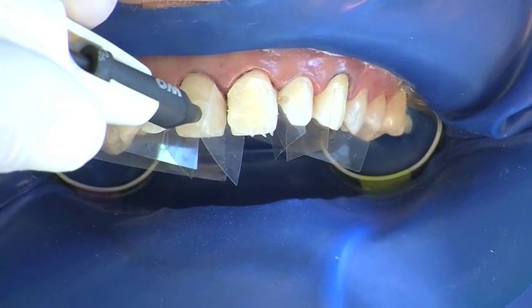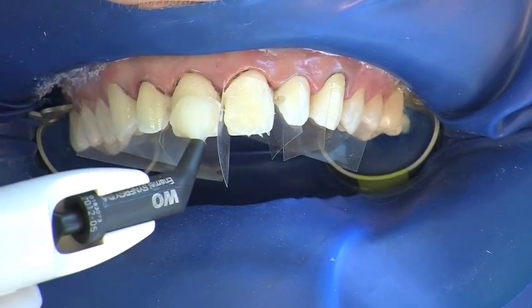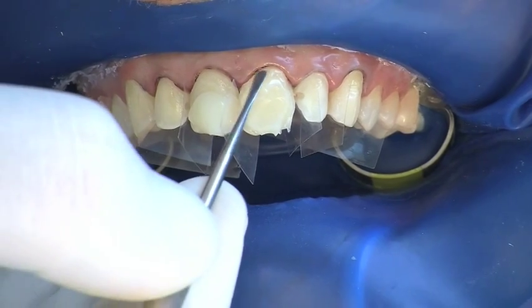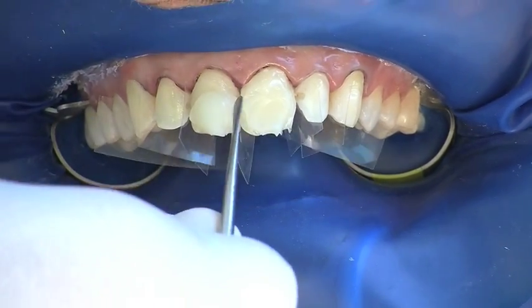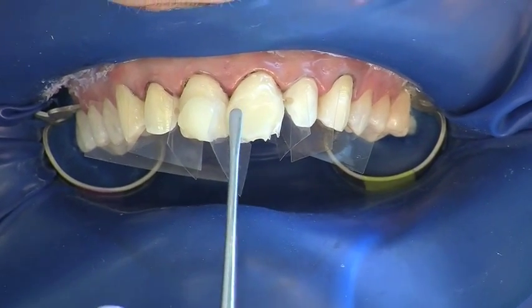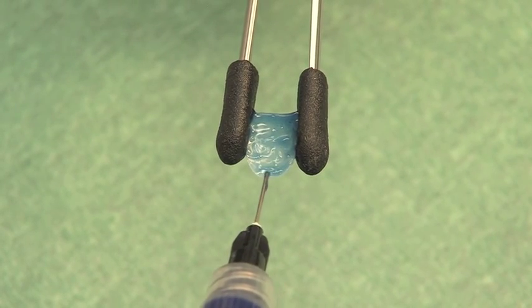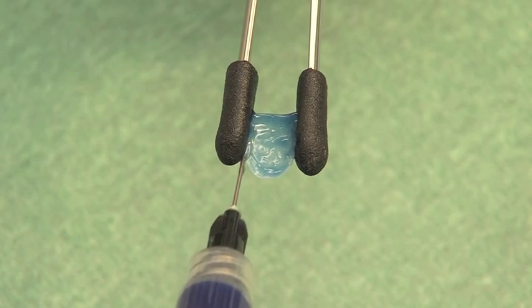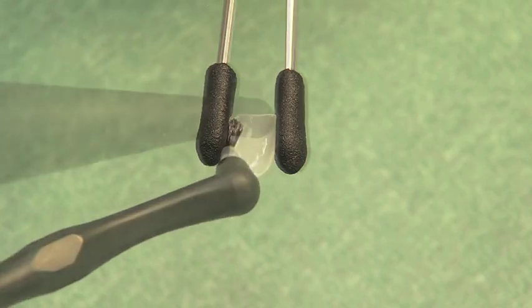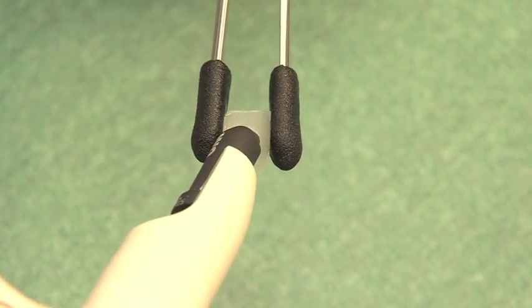The selected luting composite is applied directly to the tooth and evenly distributed. At the same time, the Componeers are prepared by the nurse. The Componeer holder is suitable for carrying out pre-treatment. If the Componeers have been contaminated, they are cleaned for a short period with phosphoric acid. One coat bond is applied to the inner surface and the margins, blown to a thin layer and not pre-cured.